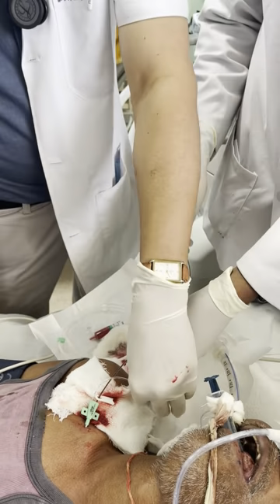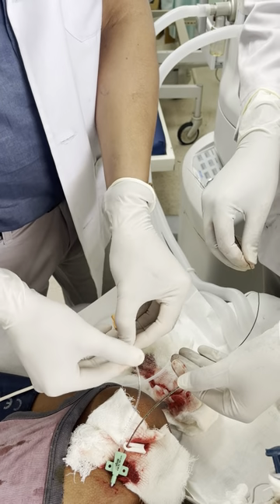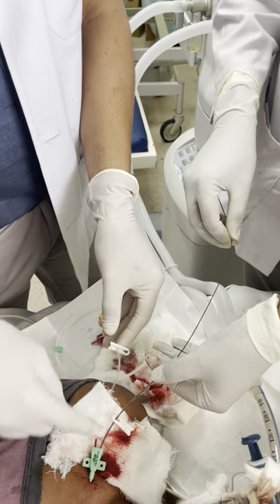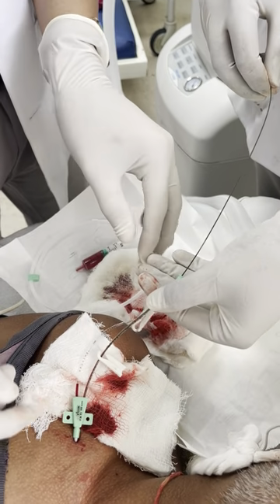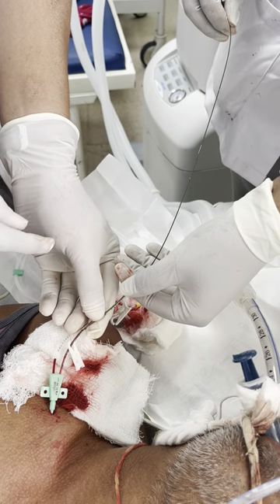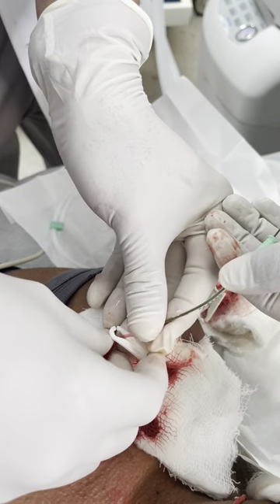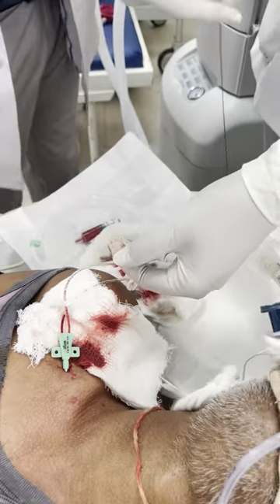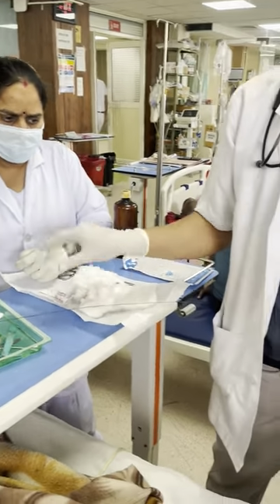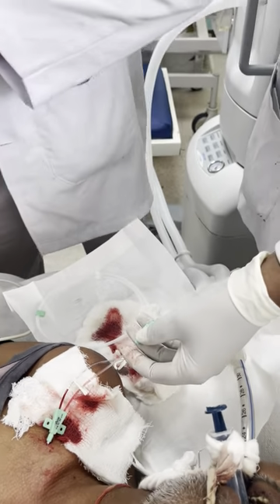So what will you do? Since we are not using this, we will close it. Number one. Since we are using this, we will close it once the wire passes this. Let the wire come. Oh, slowly. Slowly. Remove it. The wire has passed. So you will close it. Now remove the wire. The wire has been removed successfully. Now, remove this blood. No. Never go dry.